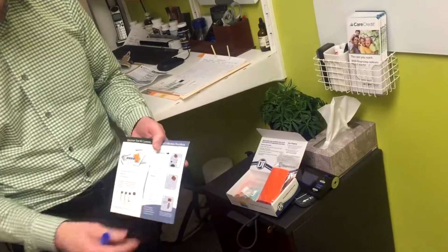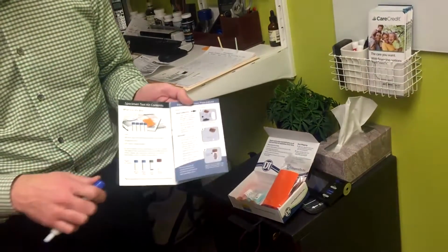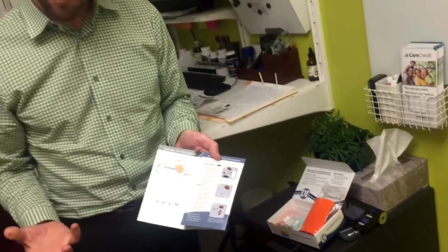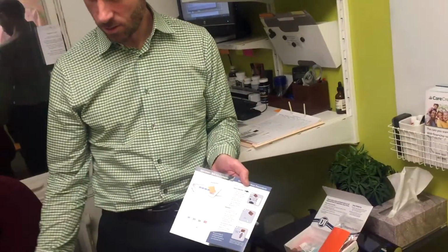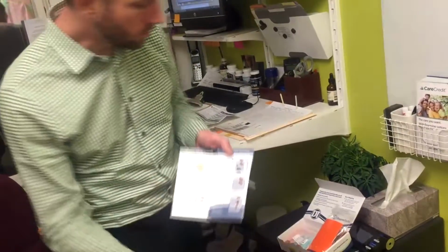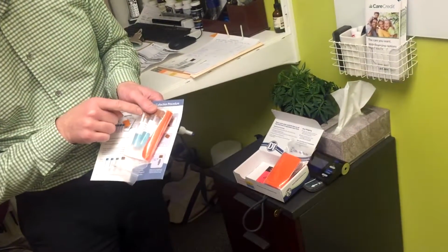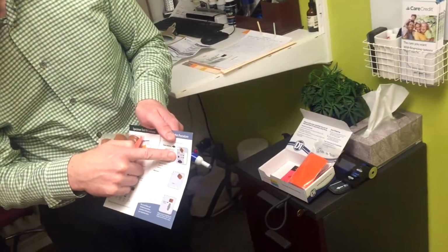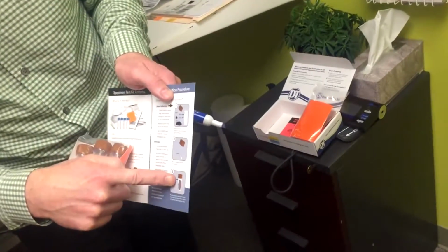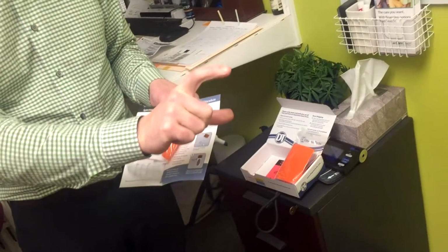Now for the stool collection, which is also here, steps 1, 2, 3. What you basically do is get a little bit of saran wrap and put that in the bottom of the toilet seat, push it down a little bit so it has a little catch, and collect the stool. Then you're going to use a little scooper device, a little spoon attached to the lid. So you pull the lid off and use that to scoop and fill up as shown there. You fill it up, break the spoon off, put the cap on, and then shake it really good. Then store each one in the fridge as you do it.